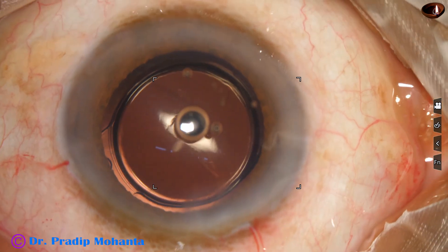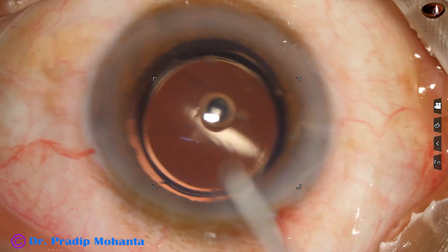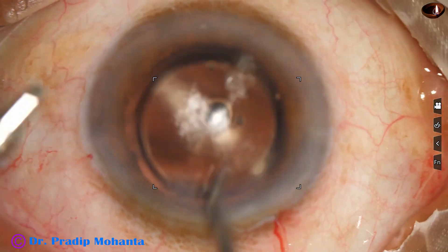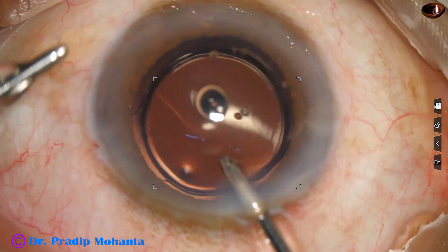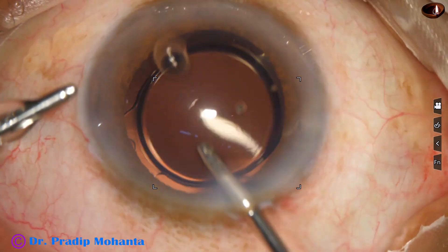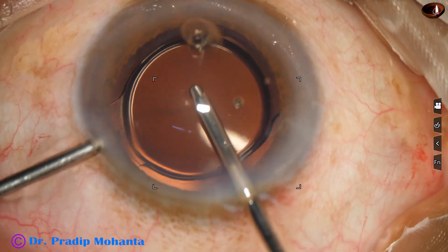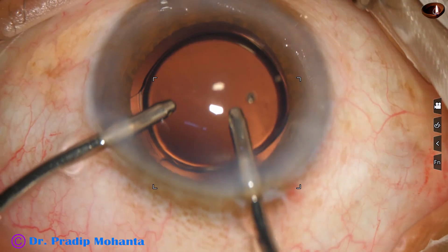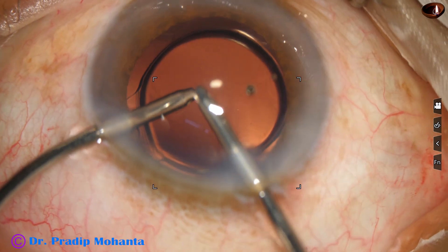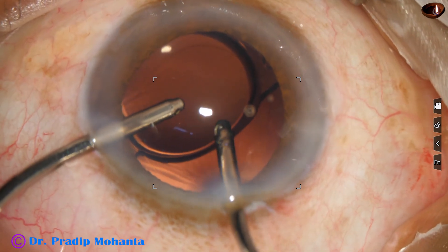Now we are near the end of the procedure. The patient is constantly moving his eye and can't keep the eye in a still position. And now I am removing some cortex using irrigation and aspiration in front of the lens.